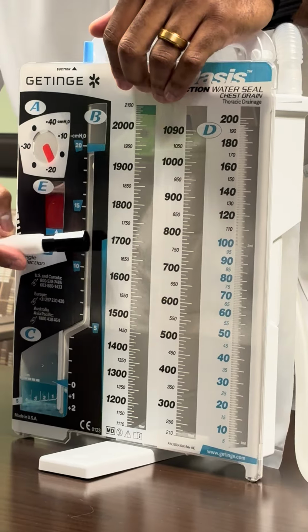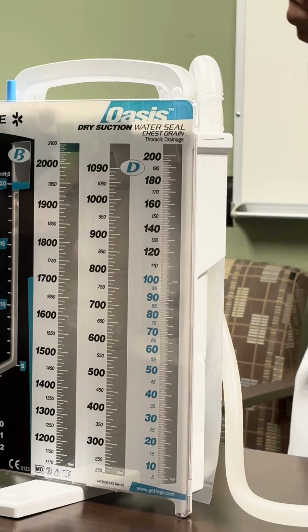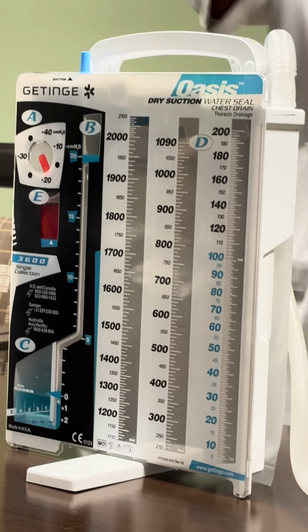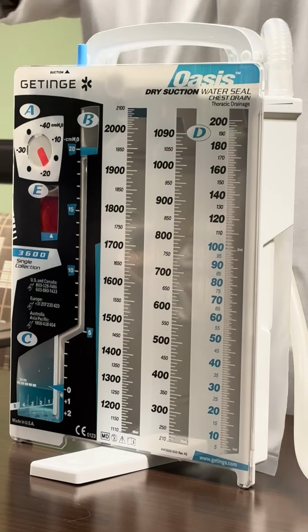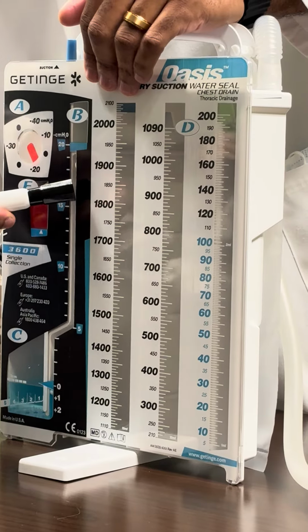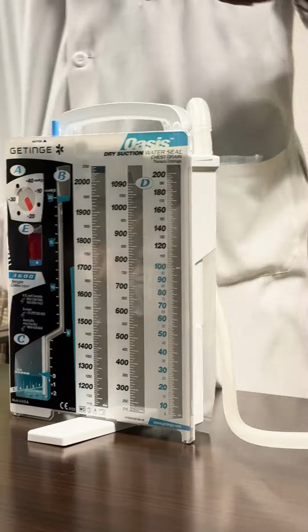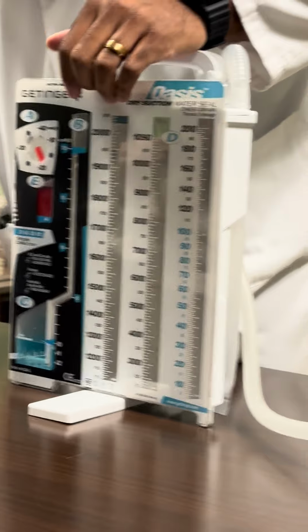Sometimes that can indicate some obstruction of your tubing, okay? So maybe there's a clot there that is causing some increased pressures intrathoracically and you're not draining properly. Somebody with an expanding pneumothorax, so if you have somebody with high intrathoracic pressures and a raging air leak, that would indicate maybe you have a worsening of a pneumothorax, maybe even tension physiology starting to form there.